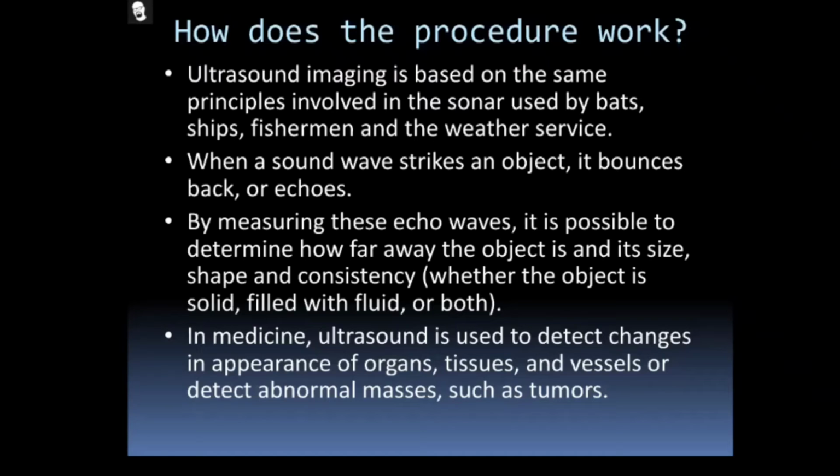All the returned waves give some echoes. Those echoes, or the bounced signal, will be received by the transducer. That is a very important thing. By measuring these echo waves, it is possible to determine how far away the object is. Please remember, see how far the signal has traveled and how far the signal is reflected. Through that, we can identify the distance.